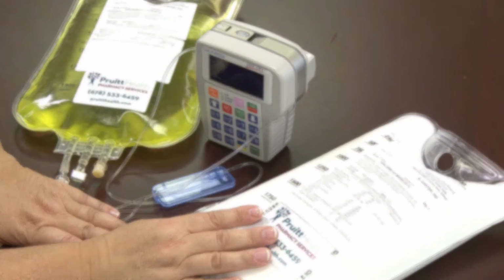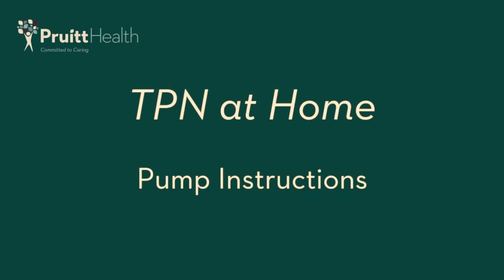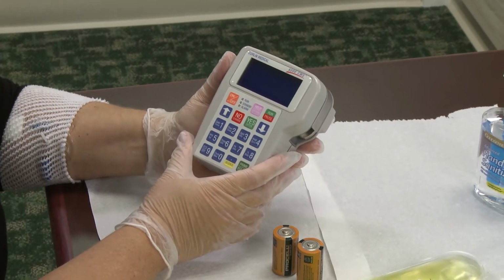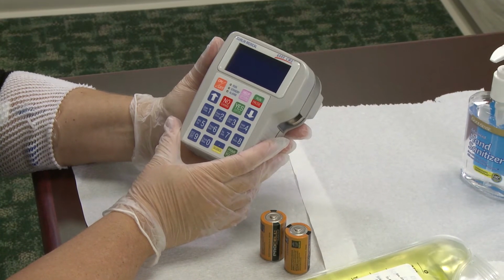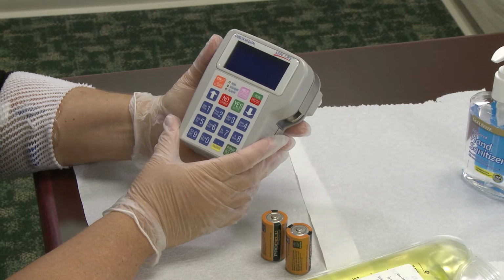So today we're going to talk about doing TPN in the home setting. TPN is total parenteral nutrition, which is all of your food IV. Now we're going to talk about your pump for your TPN. Our pharmacy, Pruitt Pharmacy, is going to send you the Curlin pump to do this.